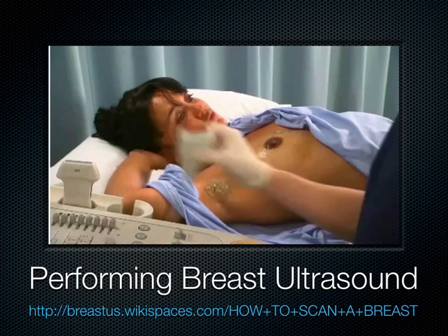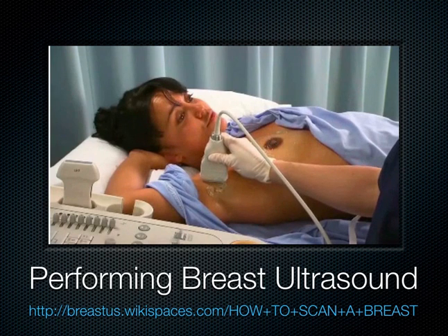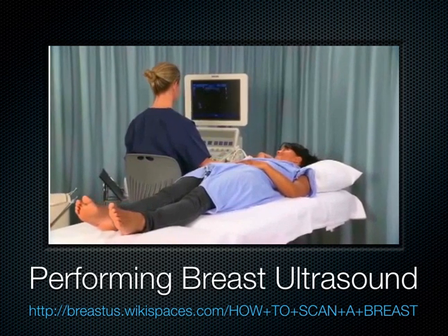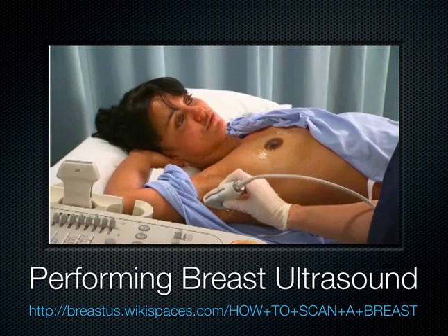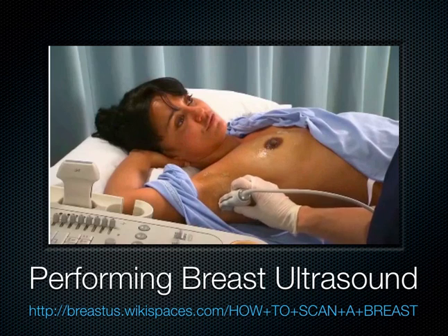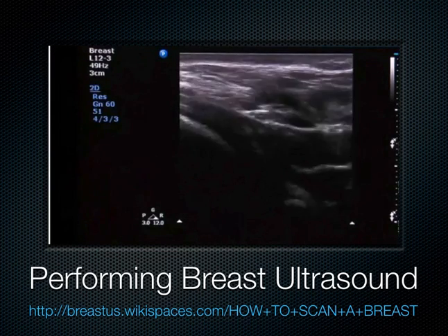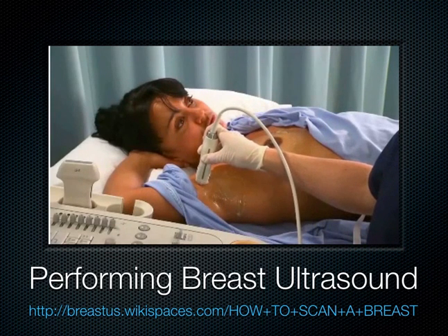To scan the axilla, place the transducer in the longitudinal plane of the superomedial aspect of the axilla with the notch pointing superiorly. Using a grid technique, slide the transducer horizontally towards the superolateral aspect. Then slide it inferiorly to the inferolateral and finally to the inferomedial aspects of the axilla. Repeat the process in the transverse plane.